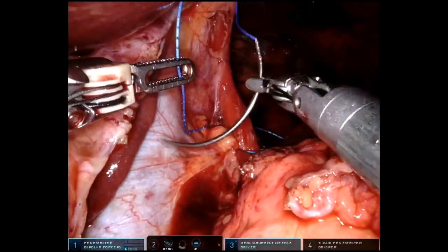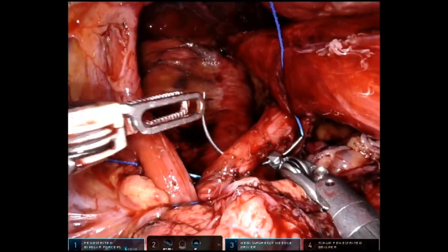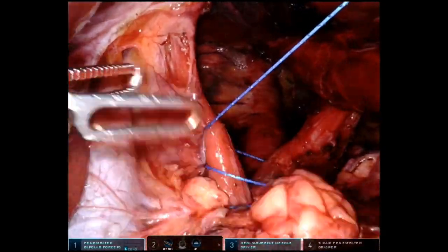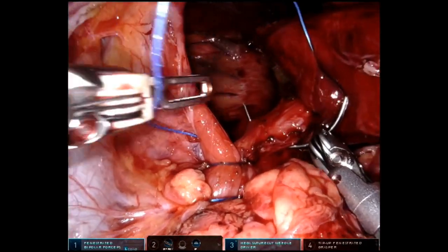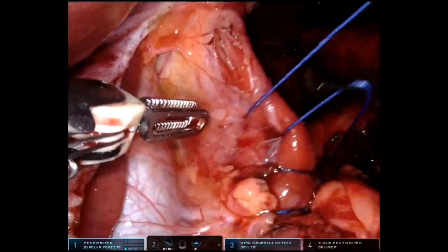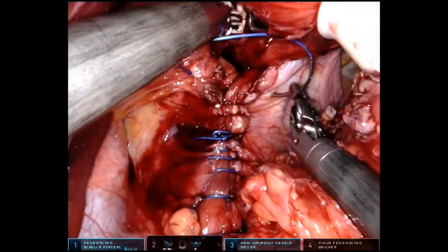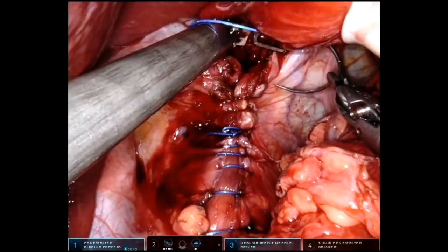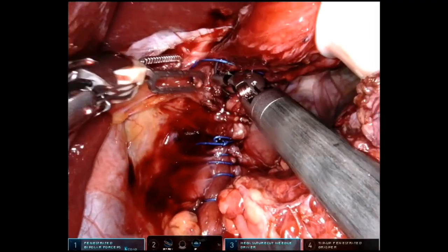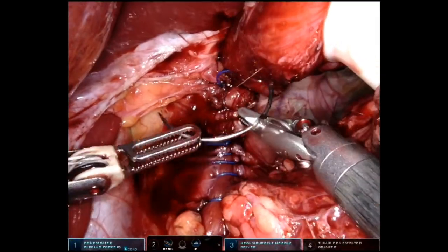You can see the IVC — the inferior vena cava — there. You have to be careful with these bites; don't take too big of a bite on the right crura or you can get into some bleeding. This is a permanent V-lock suture, which is my preference in this situation, though lots of surgeons use figure-of-eight sutures with a non-absorbable suture. Once the crura is closed, it should be tight to the esophagus, but not so tight that it causes dysphagia or difficulty swallowing. This suture locks on itself when you bring it back one or two throws.